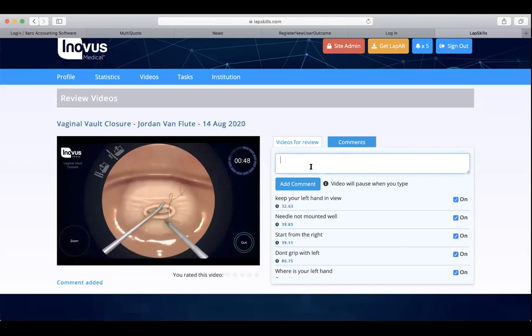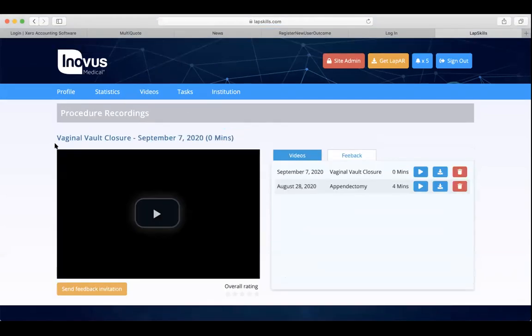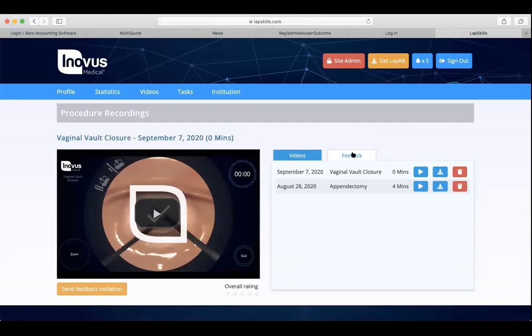But if I want to provide some more feedback, I could say, let go of needle faster. And again, once I started typing my timestamp feedback, it pauses the video. I can add my comment and then I can go back to reviewing the video and providing that feedback. And then once that feedback has been delivered, the trainee who has sent it will be able to view that back in their video library with the various comments and feedback that may well sit in that video. So that is a very, very quick whistle-stop tour of the web platform.